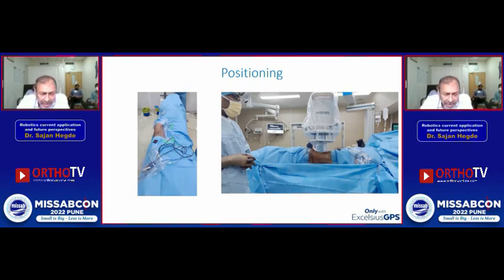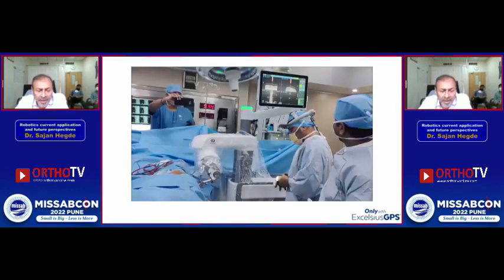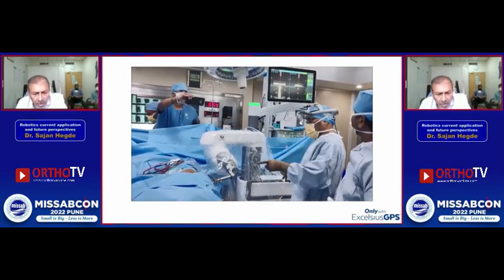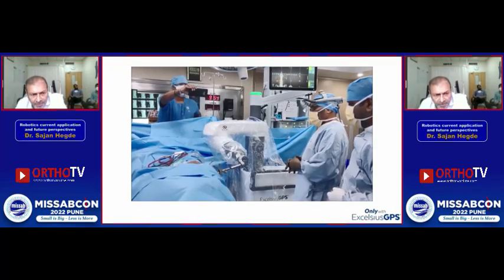So here you see the patient is positioned in the lateral, and after the CT has been done, the fluoro machine comes in, takes the views, and then the robotic planning is done. And here you see the robot moving for putting the minimal invasive pedicle screws.